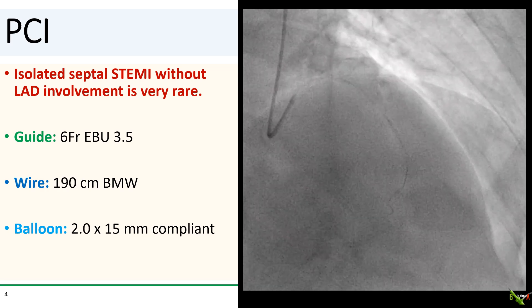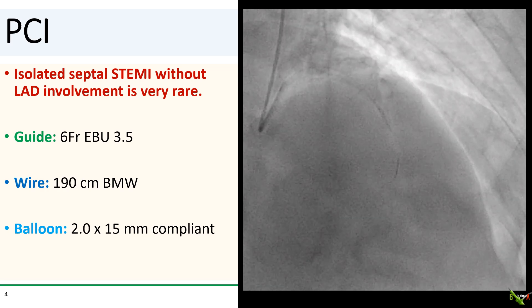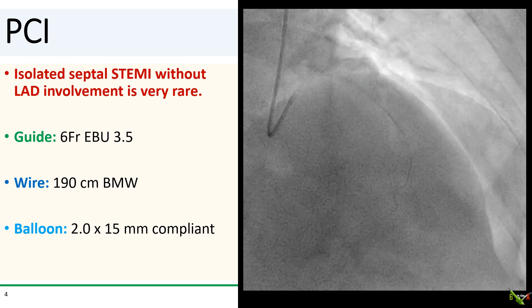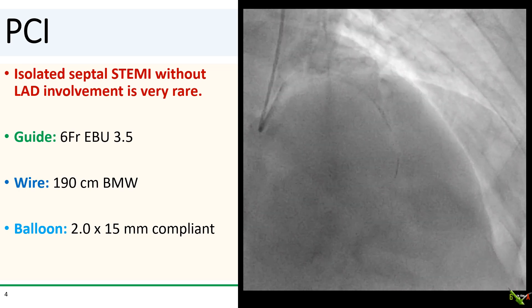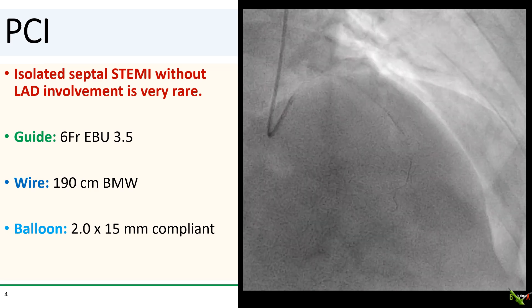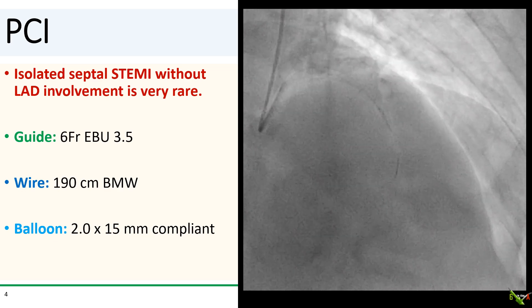I wired the vessel with my workhorse BMW and dilated the vessel with a 2.0 by 15 mm compliant balloon. I intentionally kept my balloon kind of small and my inflation pressures pretty low — six to eight atmospheres — because if it turned out that the vessel was indeed a septal, I did not want to dissect it and end up having to stent it.